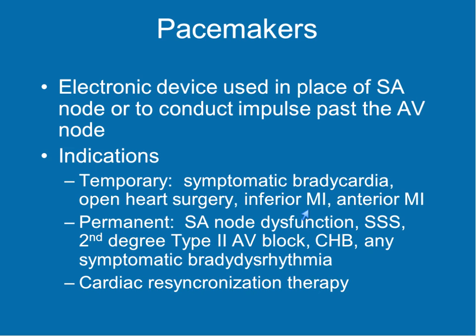synchronously. I have videos of the dyssynchrony that happens in heart failure and the resynchrony that happens with a BiV pacemaker when we do heart failure. So a patient who gets a BiV pacemaker often doesn't have to have a heart block.